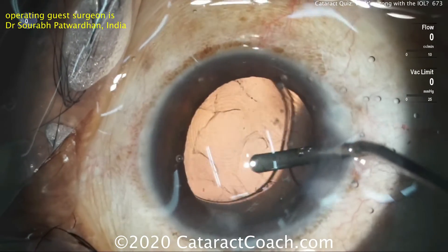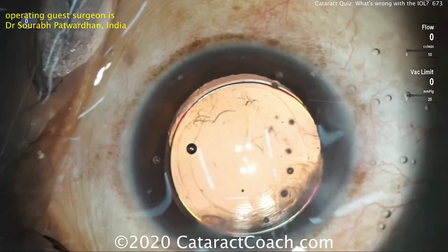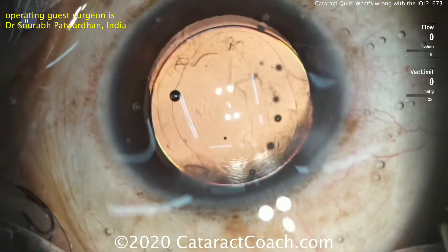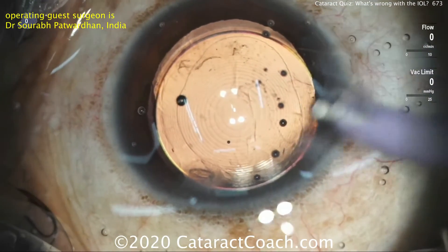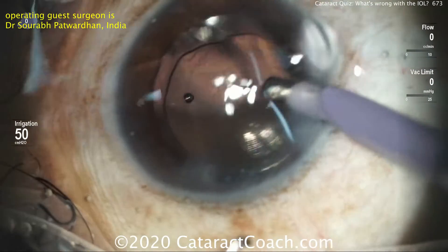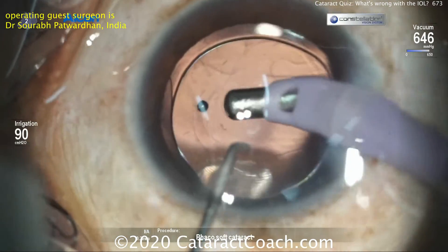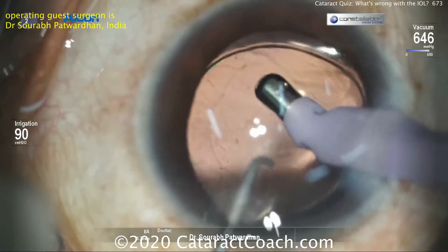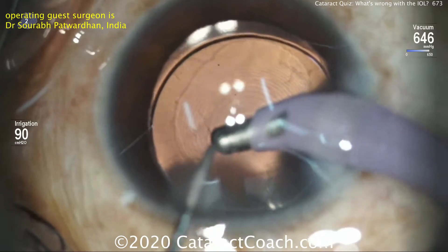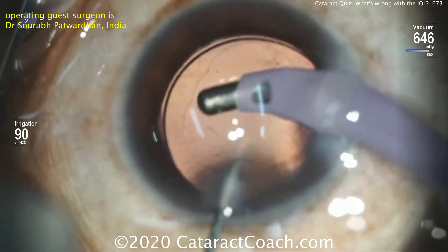Now just making sure all four haptics go within the capsular bag and underneath the rhexis — and that looks ideal. The patient had a beautiful outcome. So it's very important when you load your lenses to be very careful and be cognizant. With our typical two-haptic IOL design, it's very easy to see the orientation. Remember, we want the Z orientation — the S orientation is wrong. S is for a stupid or silly mistake.